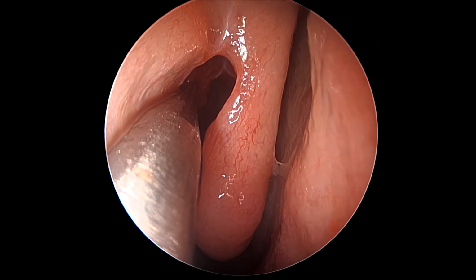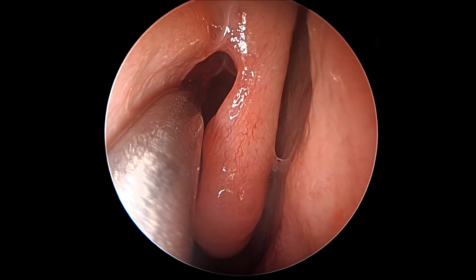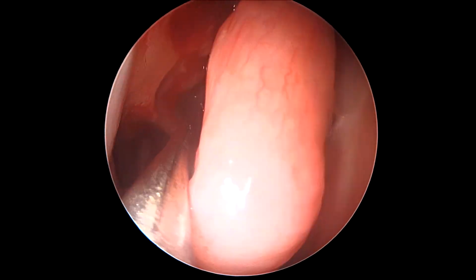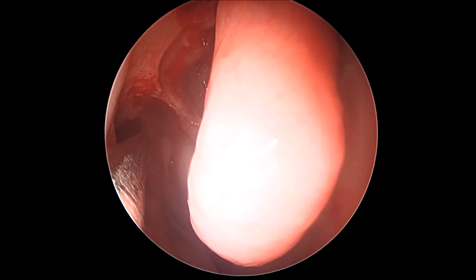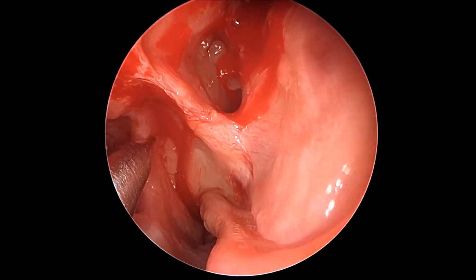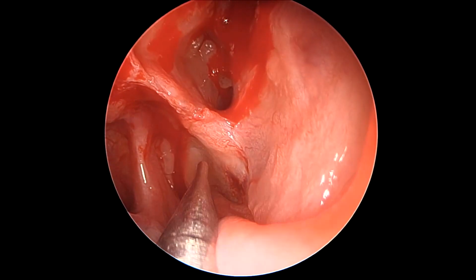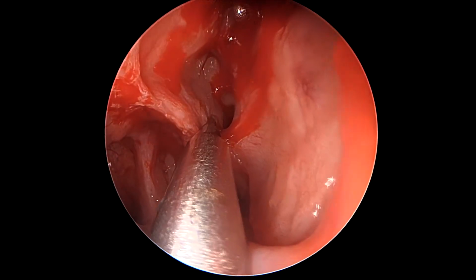So here we're just using a navigation probe to orient ourselves to locate the lamina papyracea in this patient, the ethmoids, and just to see that there should not be any tracking error before we get to the more important and critical areas.